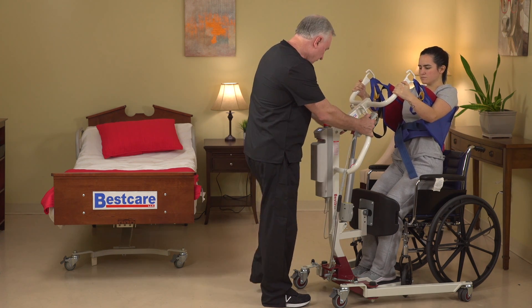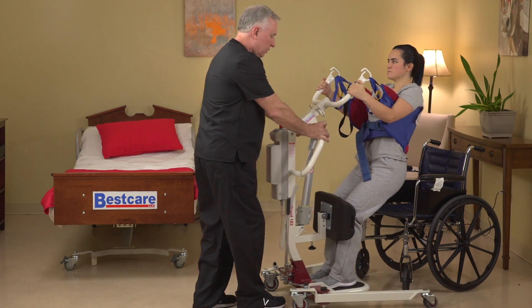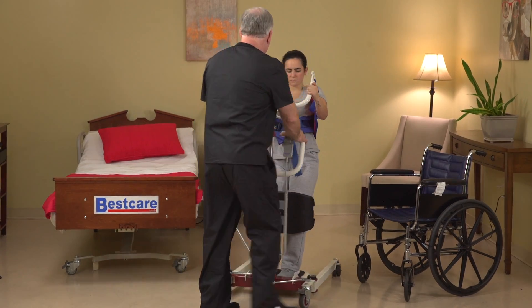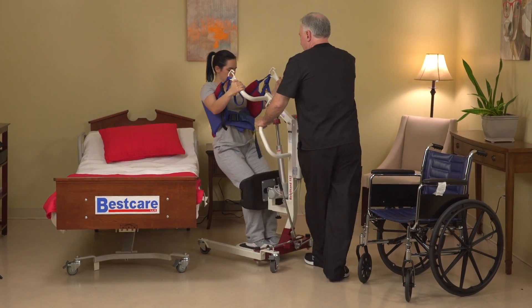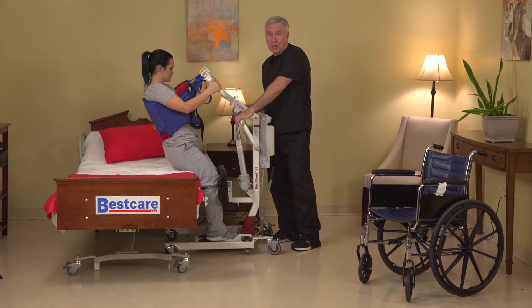Get the patient into a semi-standing position. Unlock the wheels and close the base back down. Now we can place the patient in the bed in a seated position.